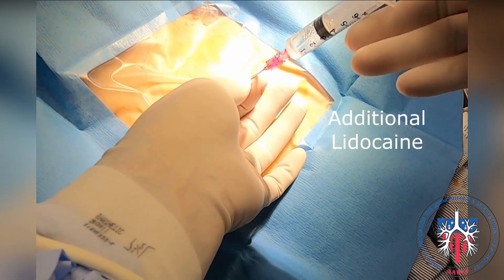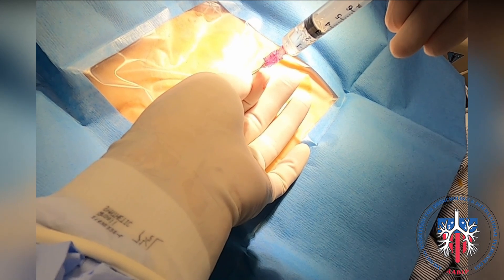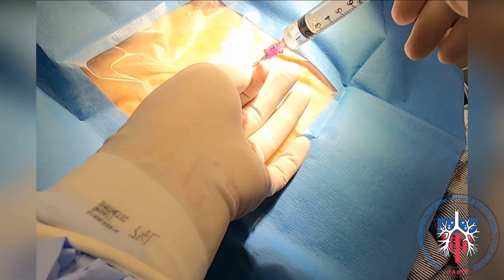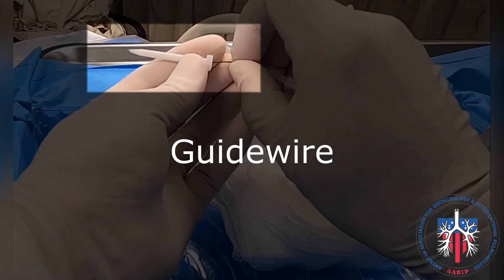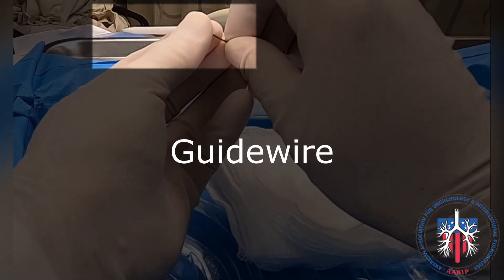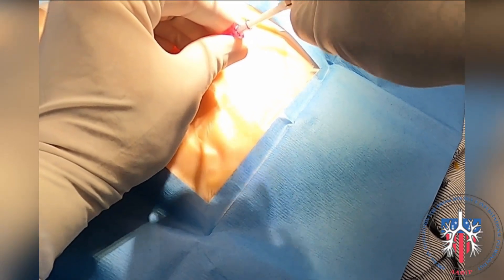Using the introducer needle, we follow the same track until we enter the pleural space, again watching for air bubbles. The introducer needle is kept in place and the syringe is detached.